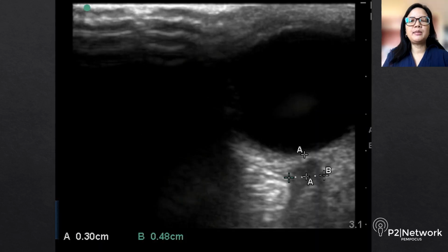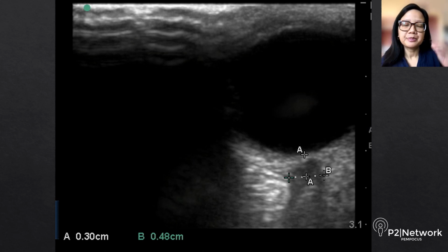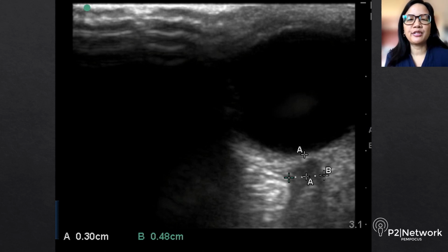When we freeze the image and measure optic nerve sheath diameter 3 millimeters posterior to the retina, we get a diameter of 4.8 millimeters, which is considered elevated in a 13-month-old child. Now, looking at this measurement in retrospect, again, here the nerve isn't entering the retina perpendicularly. The angle is more of an oblique angle, and as a result, this measurement is likely an overestimation. But I think that even with adjusting for the overestimation, optic nerve sheath diameter is elevated for the patient's age.